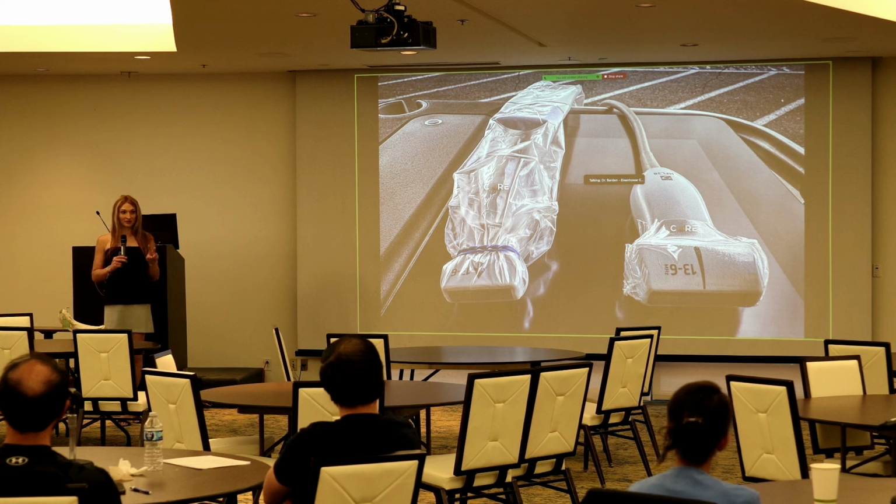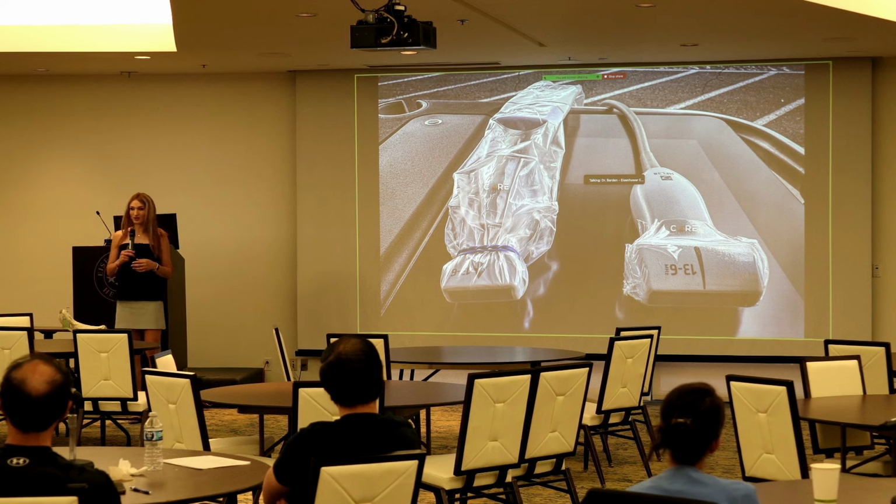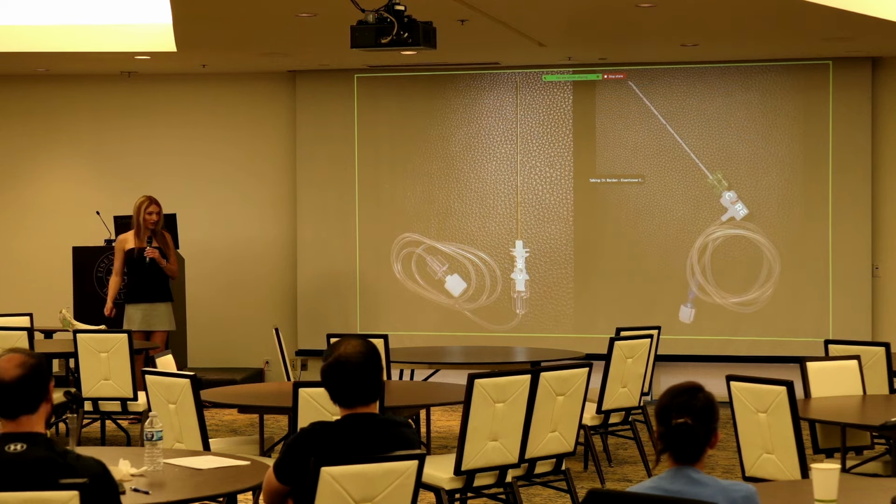that's intermediate level disinfection, which is one layer below high level disinfection, which is when you send it somewhere to be cleaned. So if you're doing it 2 minutes with a purple wipe, 3 minutes with the gray top wipe, it is way clean. There's an argument, especially for IVs, that you don't need a Tegaderm, actually. I still use it. But just know that if you clean it right with the wipes, they are clean enough to be able to do many of your procedures without that.